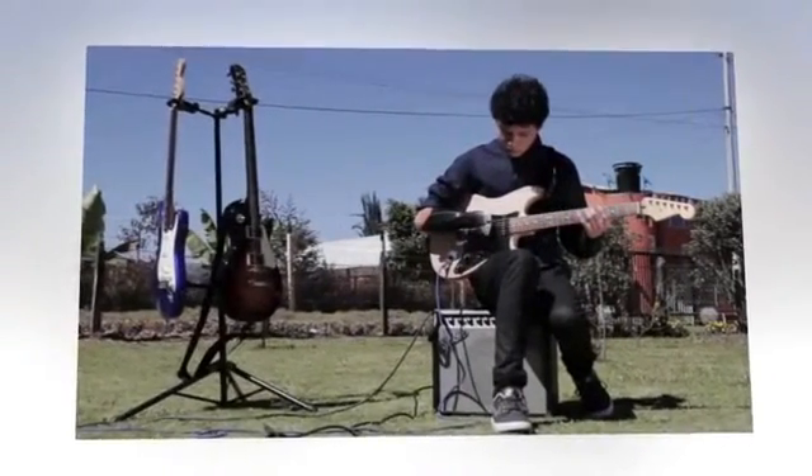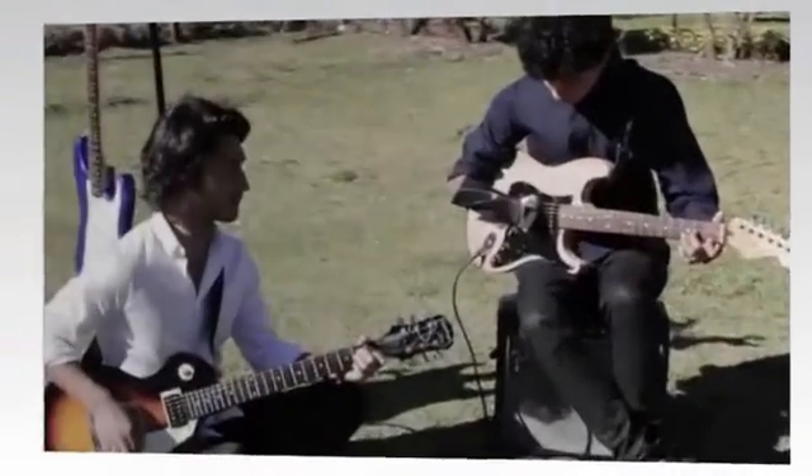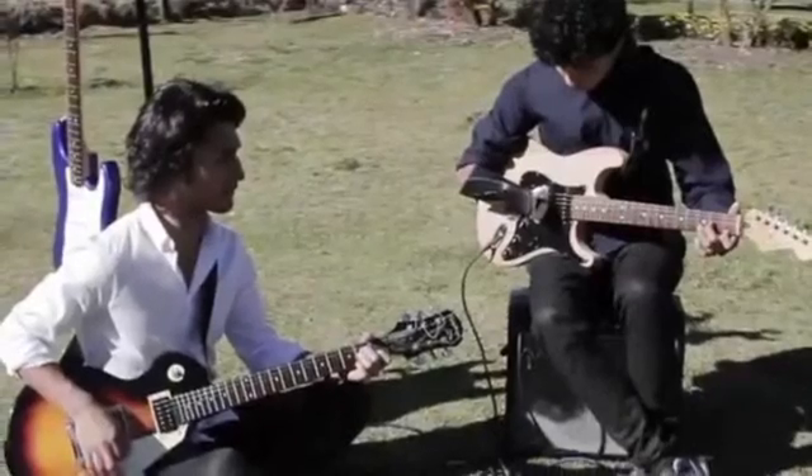Then a group of makers at 3D Gluck came along. The team worked with Corretor, who lives in Colombia, to build a custom prosthetic that he could use to play guitar.